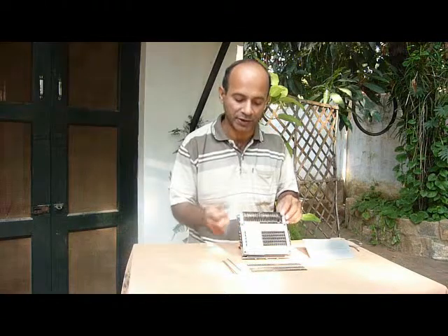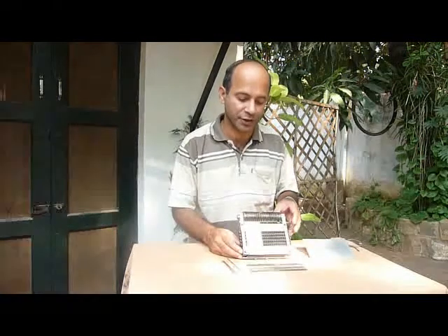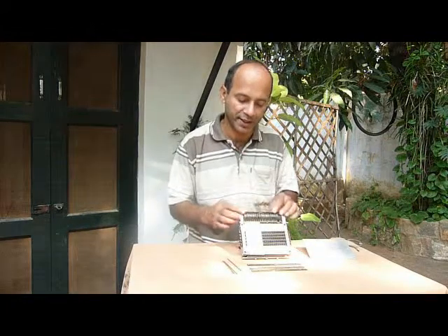If there's some other means later to actuate that's more efficient than an electromagnet, maybe they call them electronic muscles or whatever, if those things are improved on and are made to perform the way they should be, then we would be able to have more of a random access type of control, which is not really needed when refreshing a page. Even television screens and digital displays try and avoid random access to reduce the complexity of the controlling of such a huge matrix, which is the same principle that I've used here. So I trust this would explain how refreshing is done.